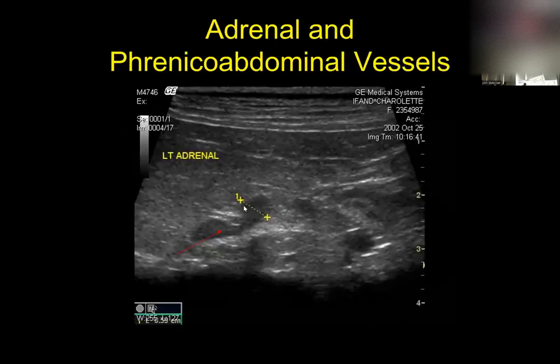That's a crappy slide. Here's a really good one. So this one looks like a peanut. There's the adrenal gland. And guess what this parallel line is here? You can see this little hyperechoic streaky thing and another streaky thing here and hypoechoic stuff in the middle.